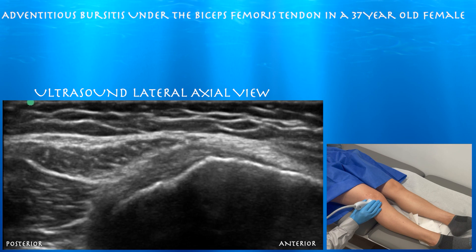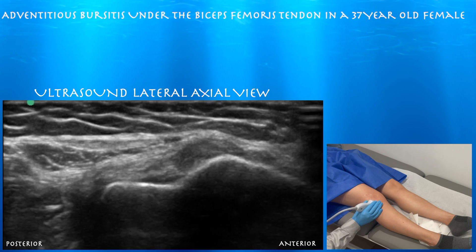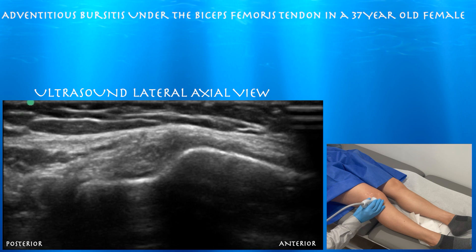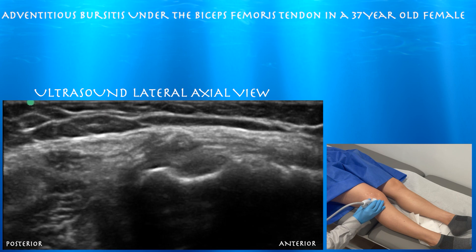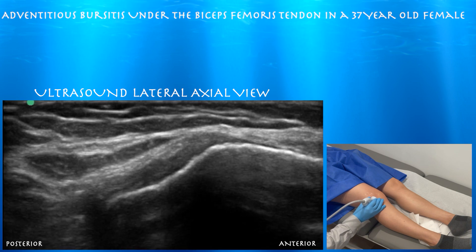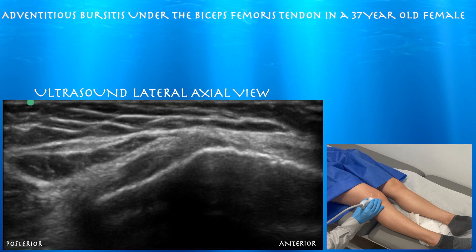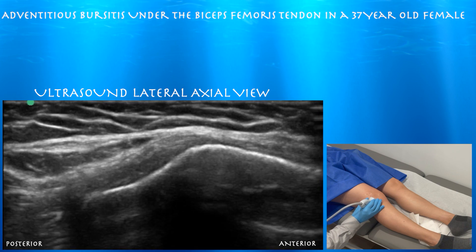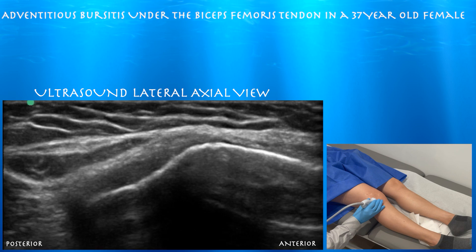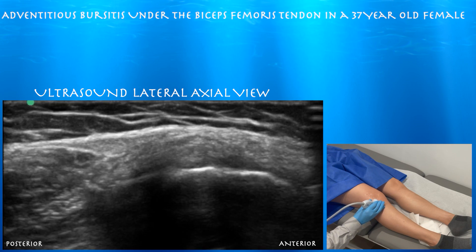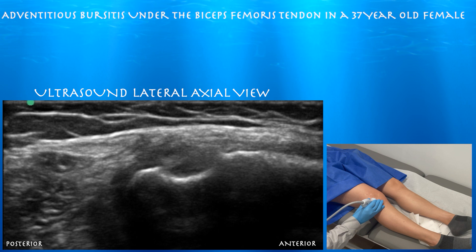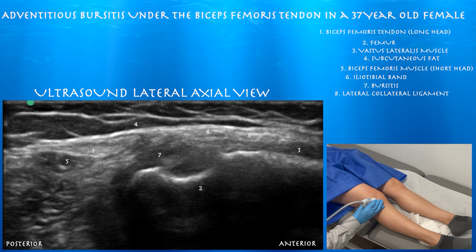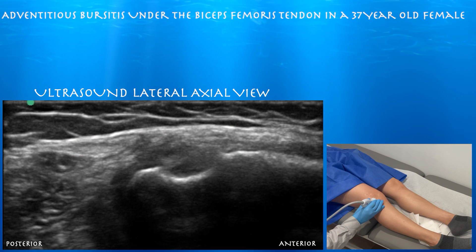Moving distally, here we can see that bursitis in an axial cross-sectional view — how it just kind of juts under the biceps femoris tendon and muscle. That's one of the nice things about ultrasound: you can really target and focus your exam on where she's tender. You can appreciate that bursitis on the anterior aspect of the biceps femoris tendon and just near the muscle — the short head of the biceps femoris.